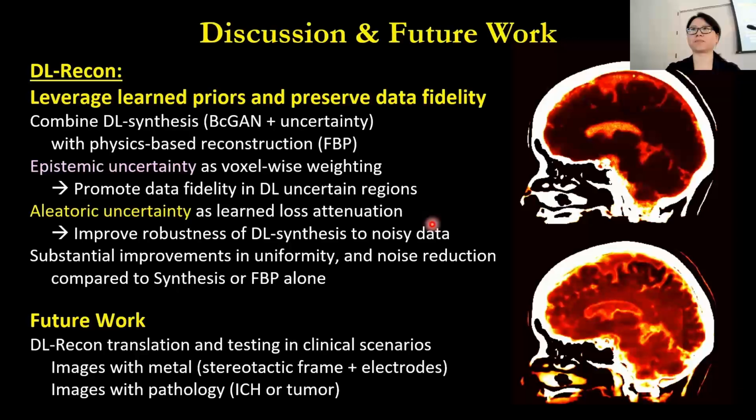Another is more like a comment. I see your difference results kind of smooth out the noise and also the structures a little bit. Is it because you are adding independent noise in your CBCT and the MDCT, like the noise processes have totally different random seeds?